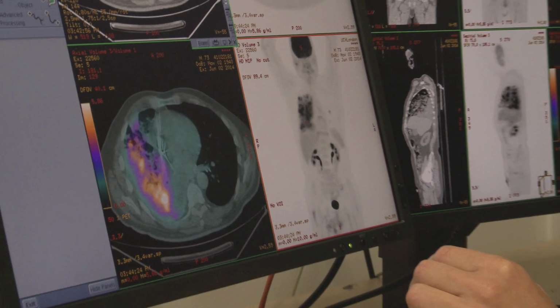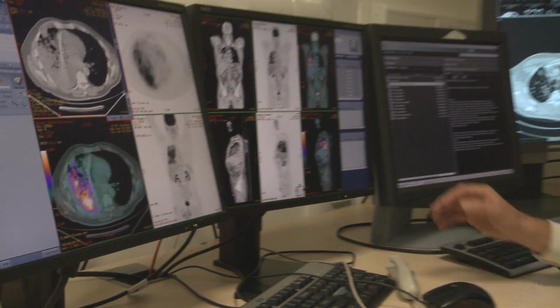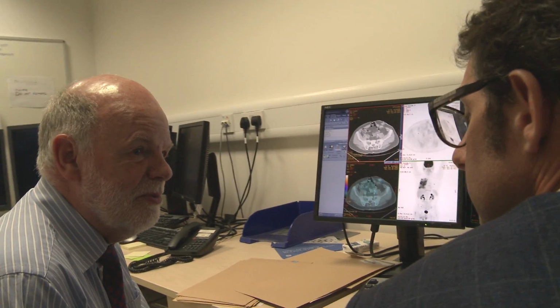single sitting. One particular area of interest is in imaging the lung, where there are particular problems associated with quantification of the data that we acquire. As we know, as a patient breathes, the lungs can move, and we are therefore looking at a moving target. It's therefore quite challenging to be able to align both the PET and the CT data so as to be able to extract meaningful information.